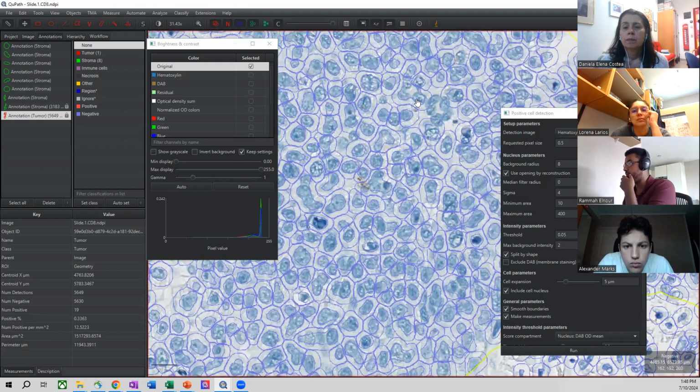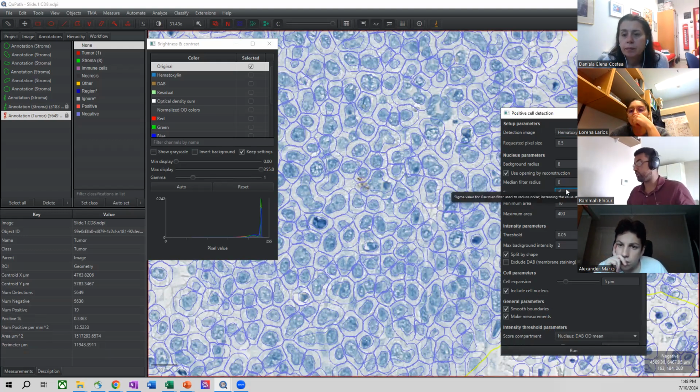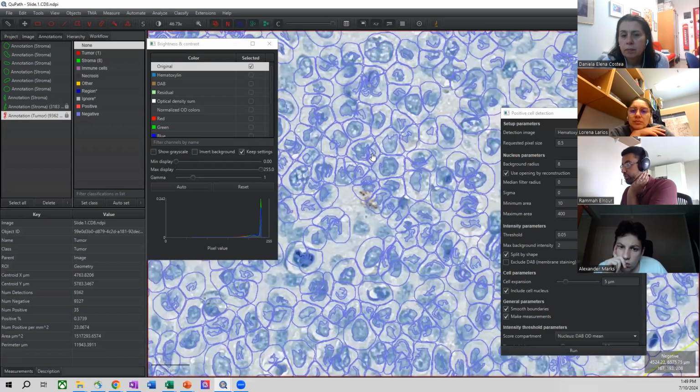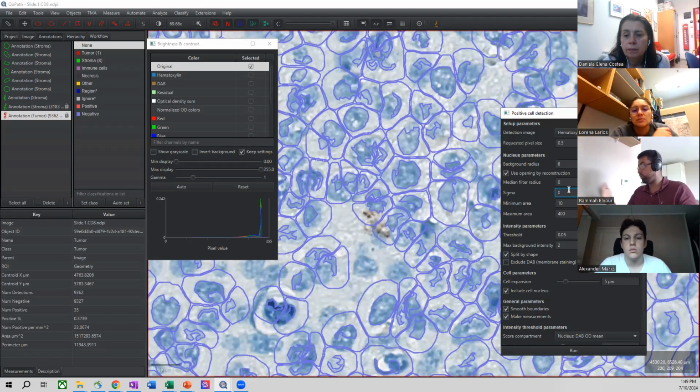And then it will also start putting together cells that really shouldn't be put together, right? They should be separated. And the vice versa is also true. If you have these too low, it'll essentially start fragmenting cells that shouldn't necessarily be fragmented. It just becomes a bit chaotic and does something like this. So again, play around with these parameters and try to make it look the best possible way within your analysis.